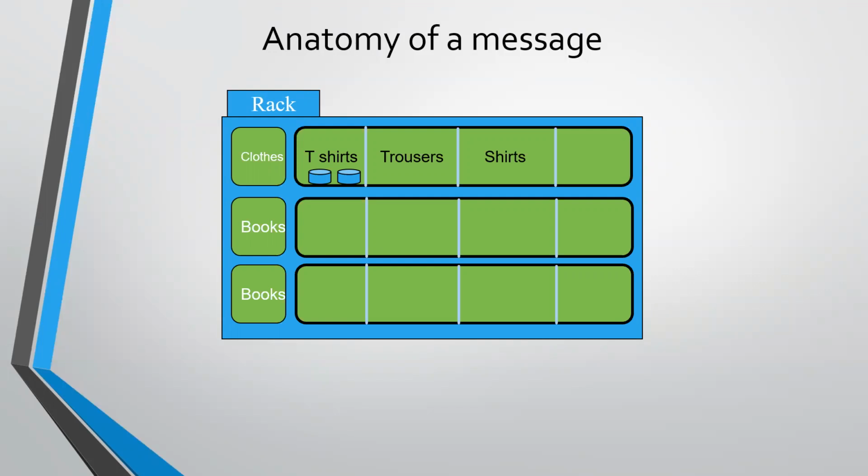Now there is no dialogue exchange about where he has to get the t-shirt from. There was only one ask from the other person, which was to get the t-shirt, and he was able to do so. This is because they know what the common placeholder for that t-shirt is. So there are common placeholders in our regular day-to-day life. In the very same way, the HL7 message structure also has common placeholders for each and every data element that is captured in the real world.